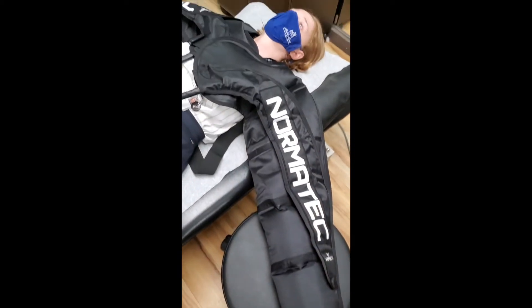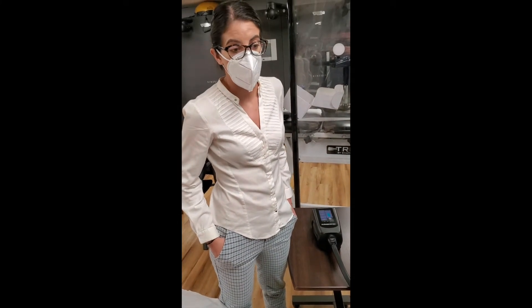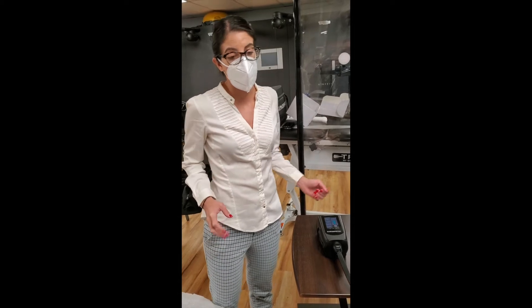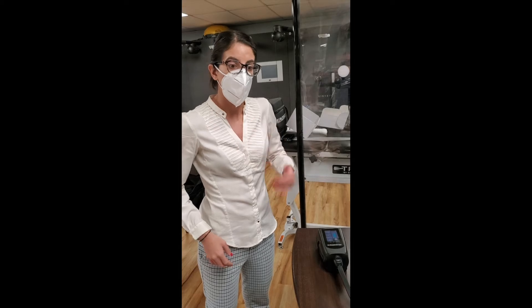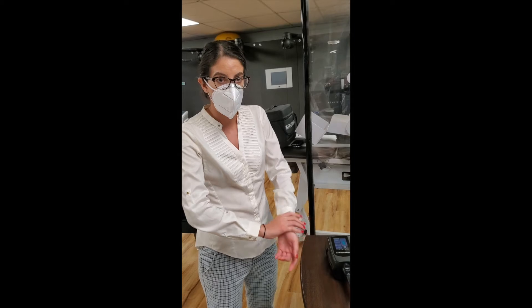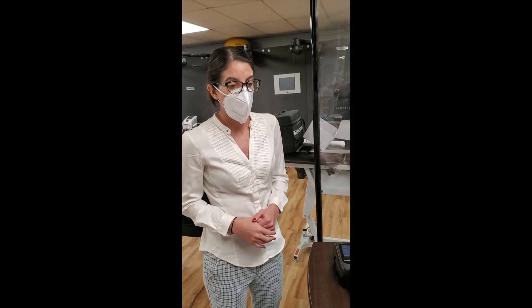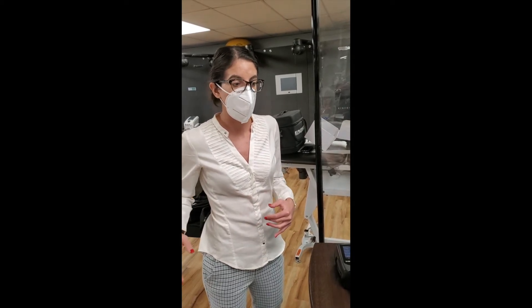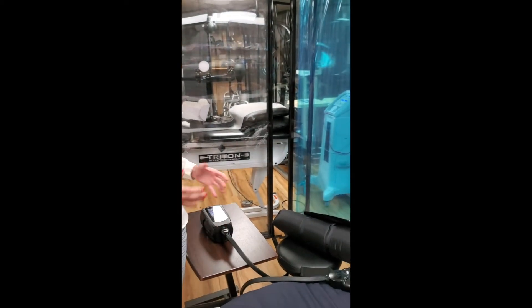As you can see, it works more distally at the hands and then works its way proximally. The goal with the NormaTec is to get blood flowing from the hand up to the heart on both sides. When you do a lymphatic massage you do effleurage massage working up to the heart — this does that work for you, or assists with that work, and helps progress the patient faster.